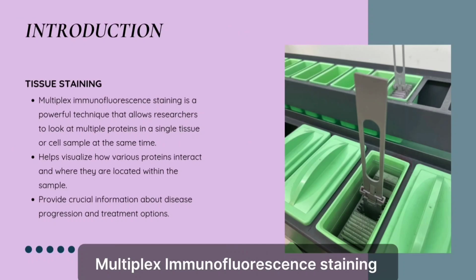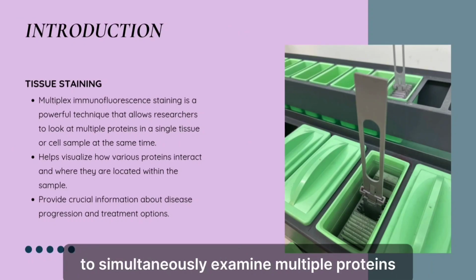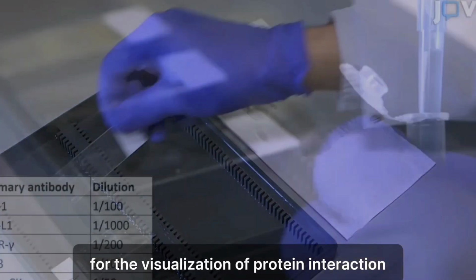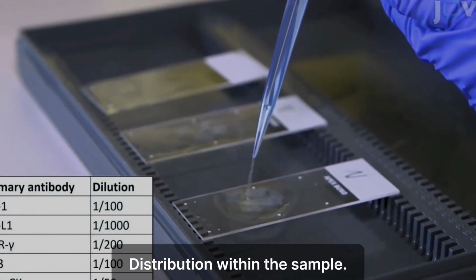Multiplex immunofluorescence staining is a powerful technique that enables researchers to simultaneously examine multiple proteins within a single tissue or cell sample by employing various fluorescently labeled antibodies. This method allows for the visualization of protein interaction and their spatial distribution within the sample.